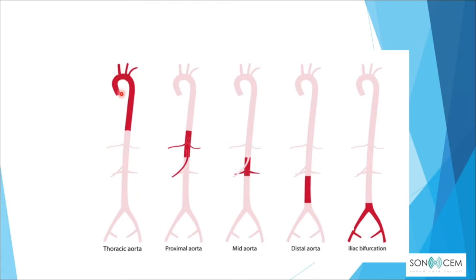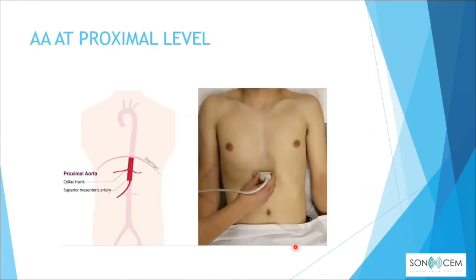For the abdominal aorta scan, we assess the proximal aorta, mid aorta, distal aorta, and iliac bifurcation. To image the abdominal aorta completely, we need four different main views: the proximal level, mid level, distal level, and bifurcation level.